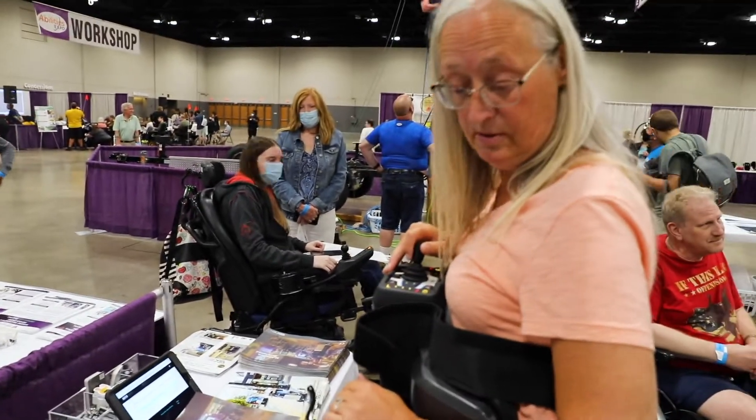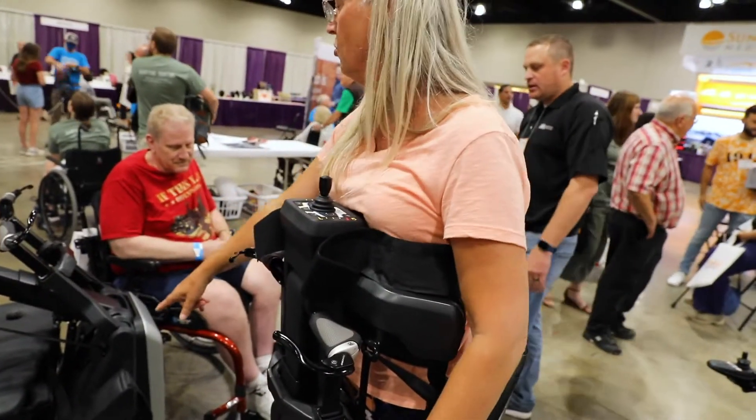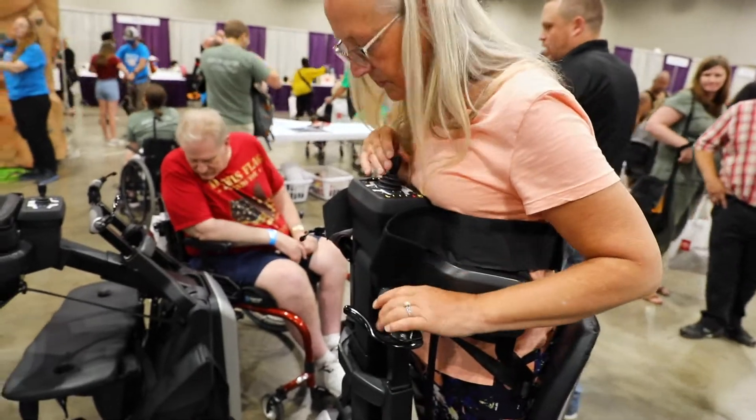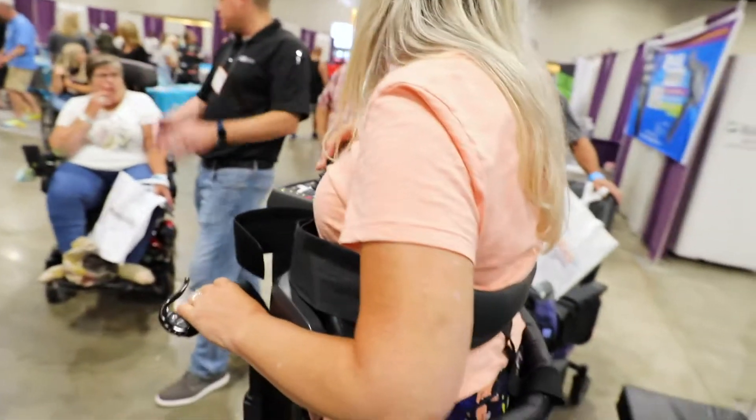This one's lighter because we've got the big outdoor tires on it. And you can actually take it from outdoor wheels — that one's indoor. This is wide, so getting doorways, closets, bathrooms — all that stuff gets a lot easier.